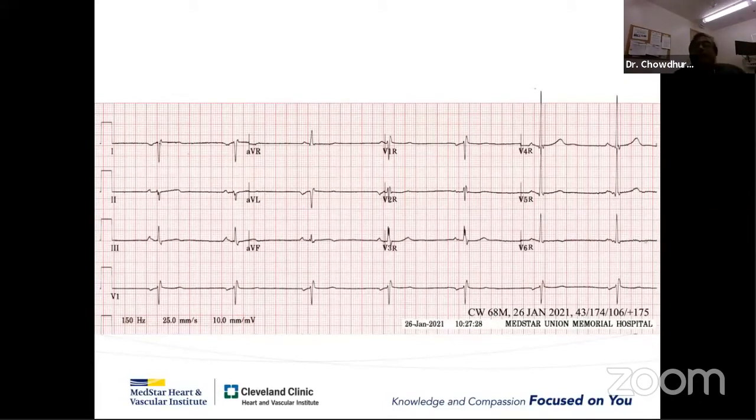In case of dextrocardia, lead 1, what will be the P? P will be upright? Oh, no. In dextrocardia, lead 1, P will be inverted. Because lead 1 is a left arm lead, and normally the electricity goes from the right to left side. In dextrocardia, the sinus node is on the left side and it is moving from left to right. So lead 1 becomes negative.